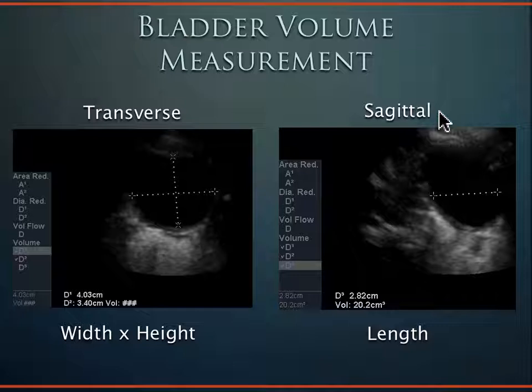In a sagittal plane, what was once the width is now the length. I'm going to say that one more time because that confuses a lot of people. Over here in a transverse plane, this is the width of the bladder. We then rotate the probe into a sagittal plane, and what used to look like the width is now the length of the bladder in a sagittal plane.